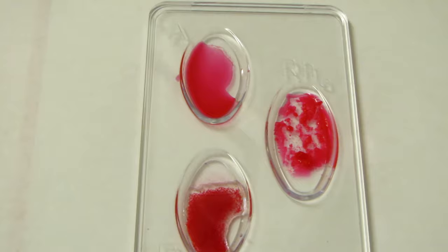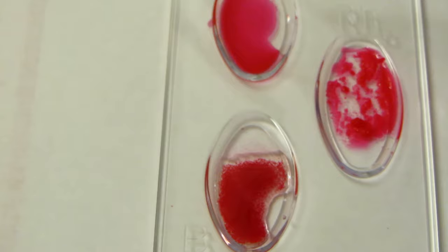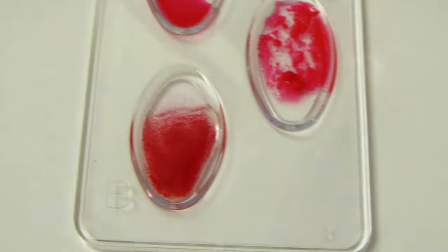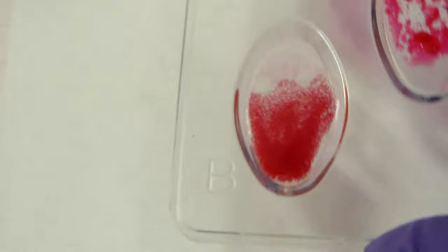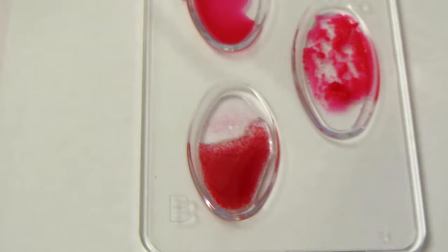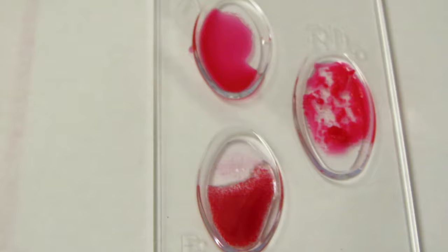Third sample: here we have no clumping in the A well, but when you look at the B well you can see all those little granule-looking things — let me rock it so you can see better. That's agglutination, i.e., clumping. We have a positive reaction in the B well, and look how clumped the RH is. So this is a B positive sample.